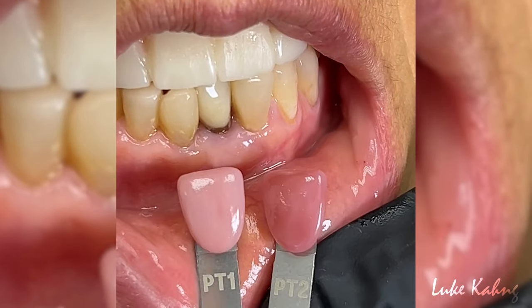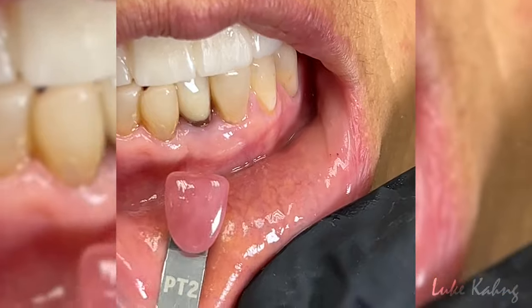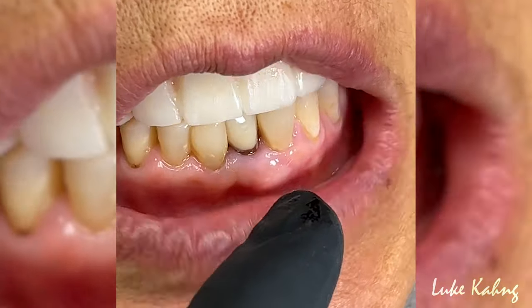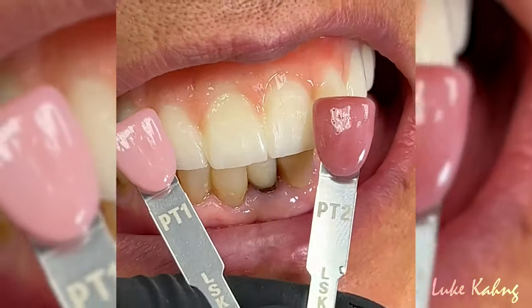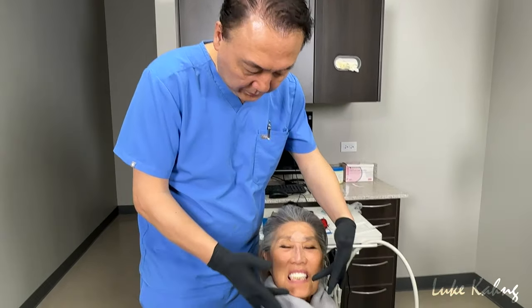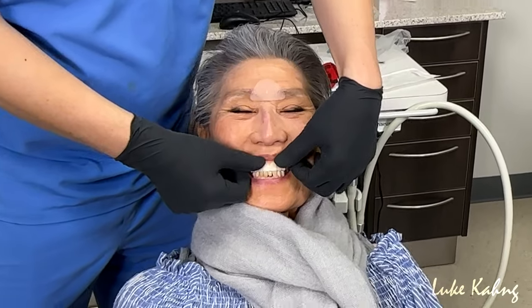Alright, so we're matching the PT1 on the top, PT2 on the bottom. This is a 1 on 5, okay. It's a 5 implant case. Okay, so after almost 2 hours we finished it, and I'm pretty happy with the facial buccal contour. But you and I designed this, so I can grind a little more in.